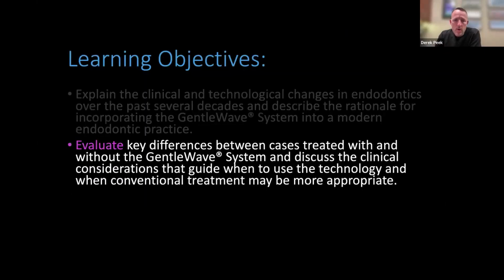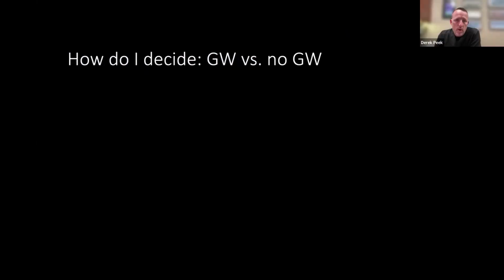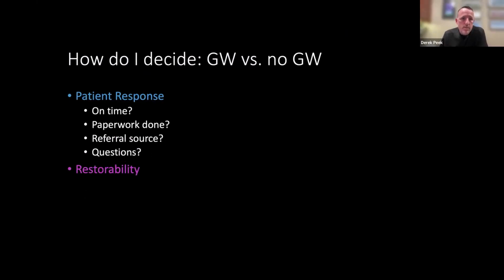So basically, how do I decide between GentleWave versus non-GentleWave? It's pretty much two things I look at: the patient and the tooth. And this is how I go down it. Is the patient on time? Have they done all their paperwork? Referrals, questions. It's the time adage.